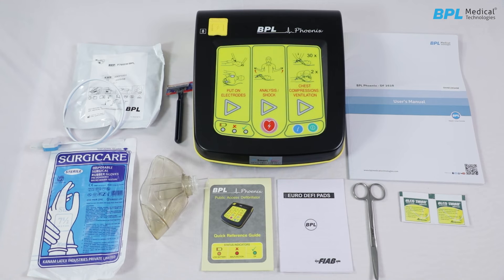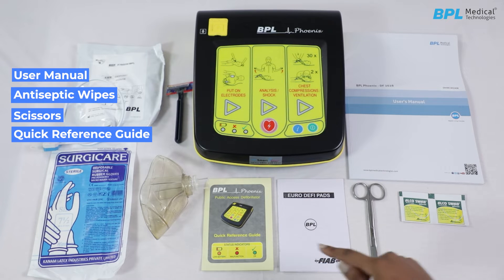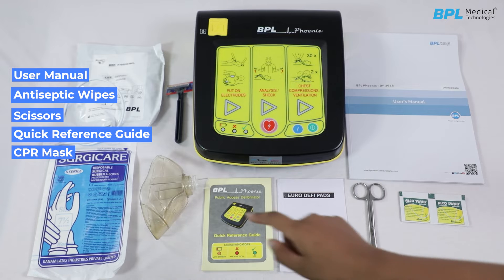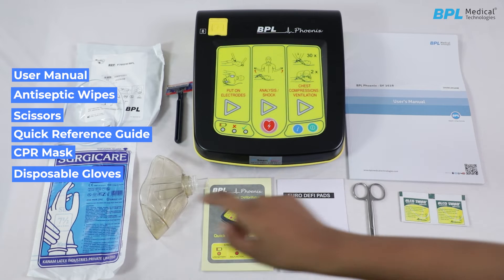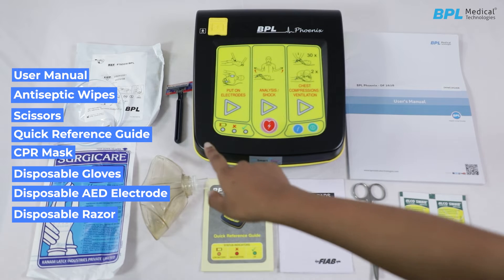The standard accessories provided with the machine include user manual, antiseptic wipes, pair of scissors, quick reference guide, CPR mask, pair of disposable gloves, disposable AED electrode, and a disposable razor.